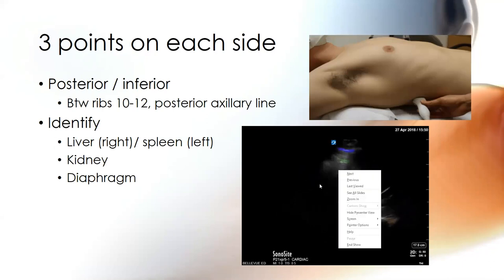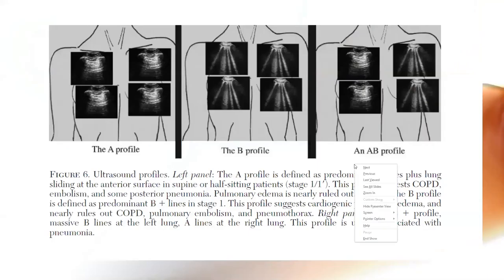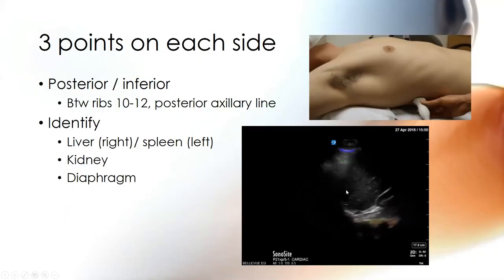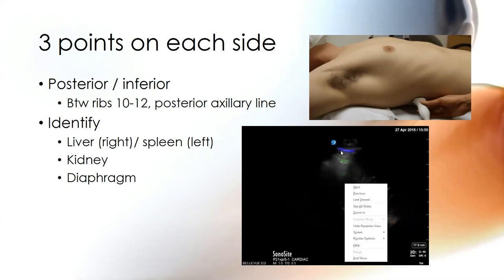So if I can freeze that, sorry, technical difficulties. I don't know if I can freeze this. Stop. Oh man. Stop. Okay. So there's actually a rib here. You might see a rib here or not, but what we didn't talk about yet is the diaphragm coming in and out. Your pleural line is here in blue. You actually see an A line in green and another A line.